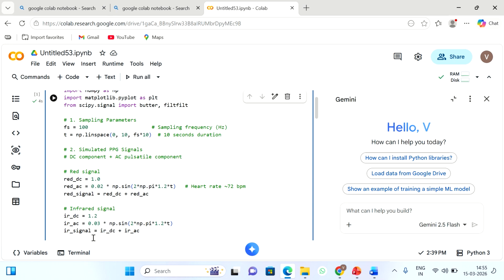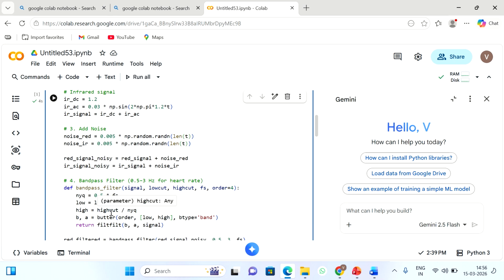The same thing is applicable to the infrared also. So the infrared DC component has a somewhat increased value. Here it is 1, but here 1.2. Normally it is more, that is why the amplitude is taken as 1.2 for DC. And then the AC value is equal to 0.03, a slightly greater value, plus np.sin, once again we have to convert into angular frequency, omega 2 pi f, with f equal to 1.2, same value, into t. So the IR signal is finally the combination of DC value and AC value.